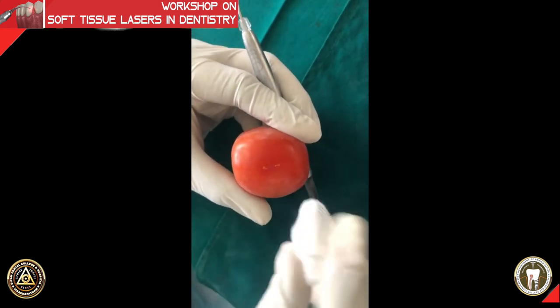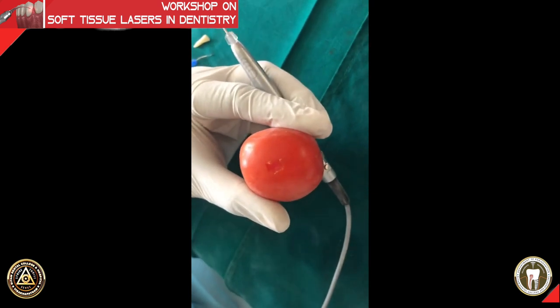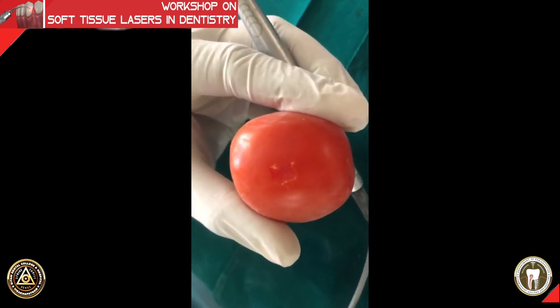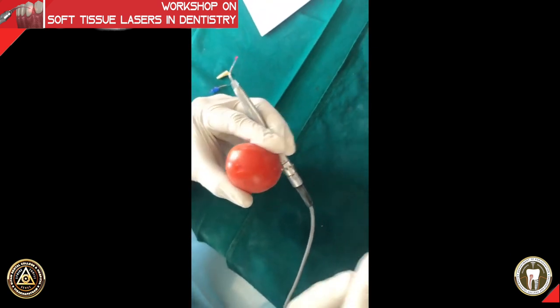When you wipe it well enough with firm pressure, the epithelium will peel off, giving you confirmation that de-epithelization has been done and that you haven't gone too deep. It is quite a simple procedure. De-epithelization is used for clinical procedures like depigmentation.